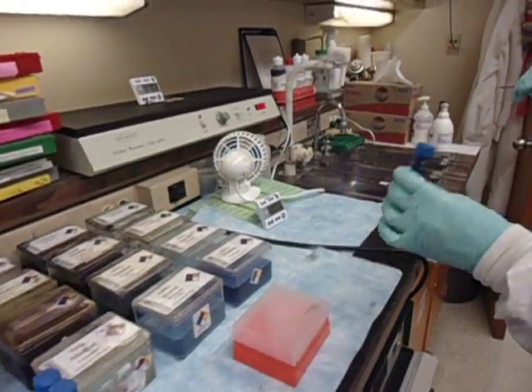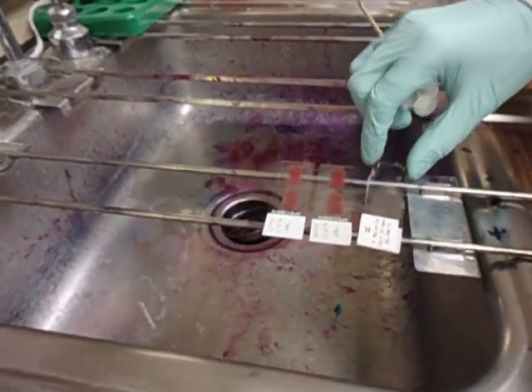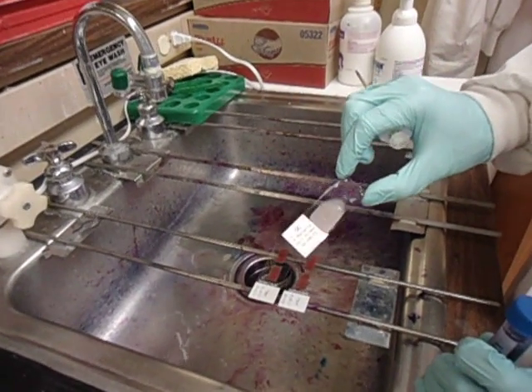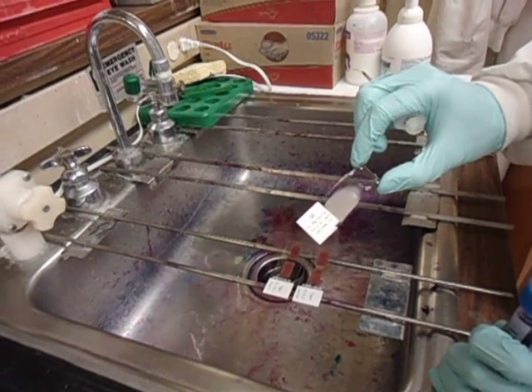Over here we'll see that I've taken a quality control malaria slide from the minus 70 freezer that we stored it in. It's a thin smear that's been fixed with methanol.